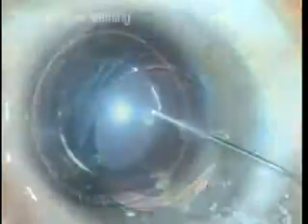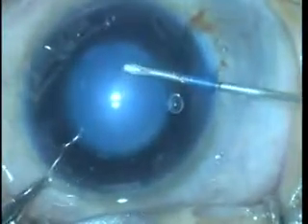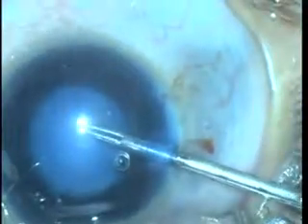A continuous circular central capsulorhexis helps to reduce intraoperative complications and improves long-term stable centration of the intraocular lens. Trypan blue staining helps to delineate the capsule well and alters its rheological properties. Use of a high viscosity viscoelastic substance helps to maintain a deep chamber, keep the capsule flat on the lens surface, and prevents radialization.